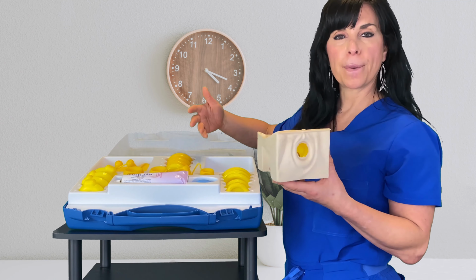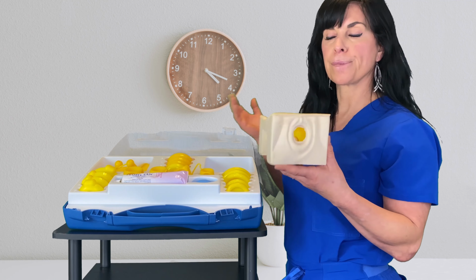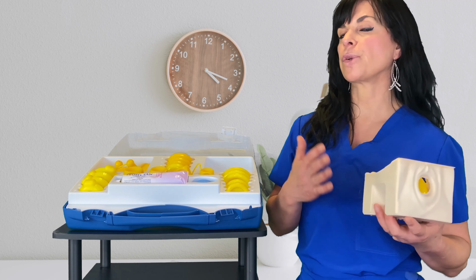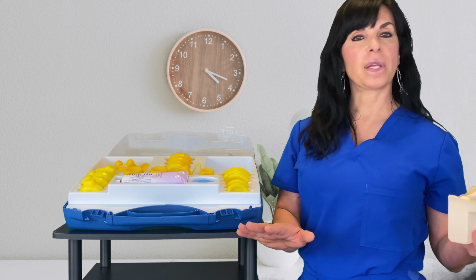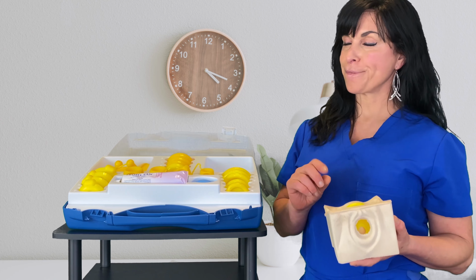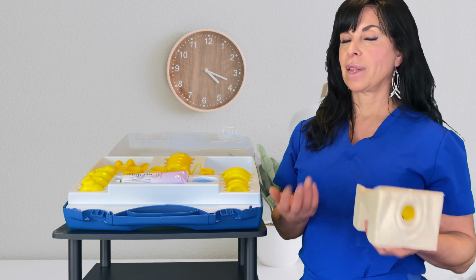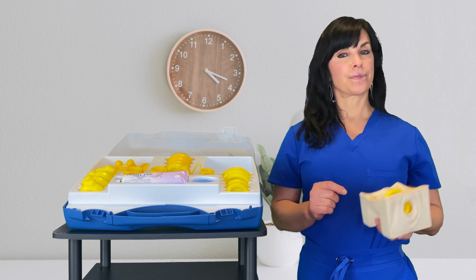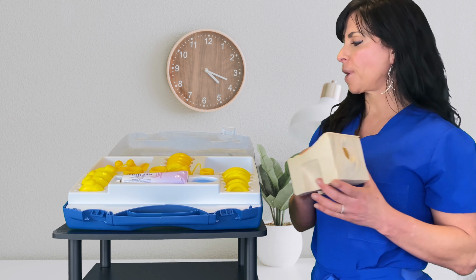And we make sure when you come into the office that you are able to do it. If you're not, we make an alternate plan. That alternate plan would be that you come back to the office and we do it for you. So every 2 to 3 months you come in, we take it out, wash it, just plain soap and water, and reinsert it. Now if you're sexually active though, and you can't manage it yourself, then this is not something for you. However, you could have your partner take it out. So your partner's welcome to come in and we'll show them how to do it.